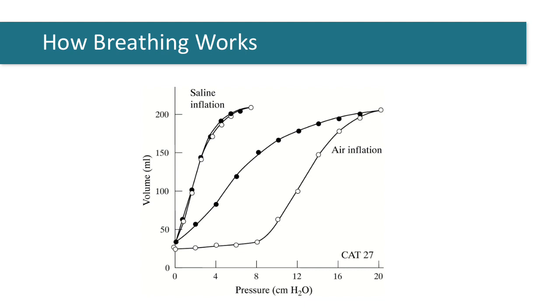On the expiratory limb, as gas flows out of the lung, you can see that lung volume remains relatively preserved as pressure decreases and falls relatively later as pressure returns towards zero.